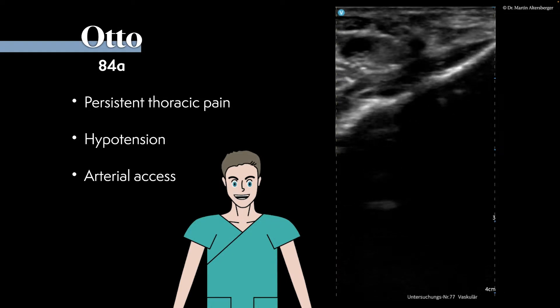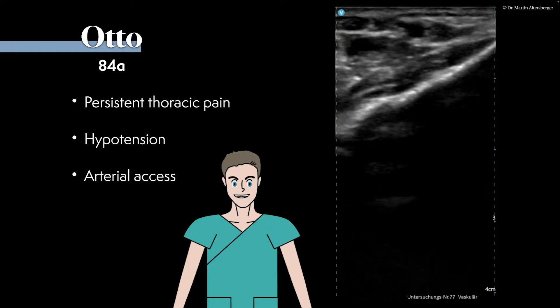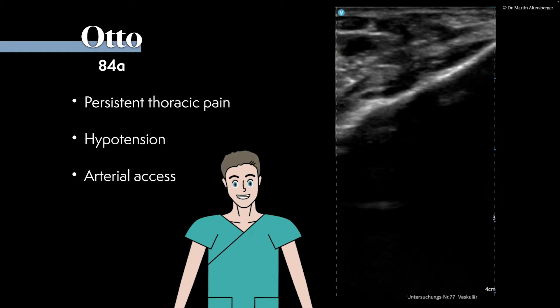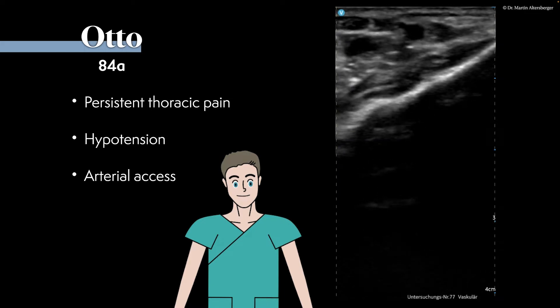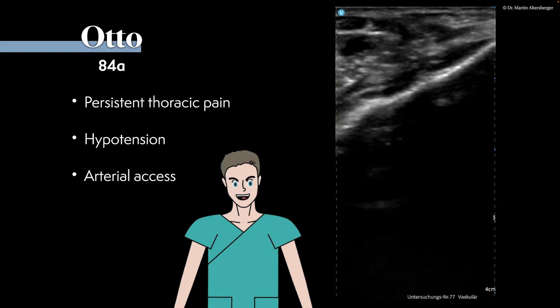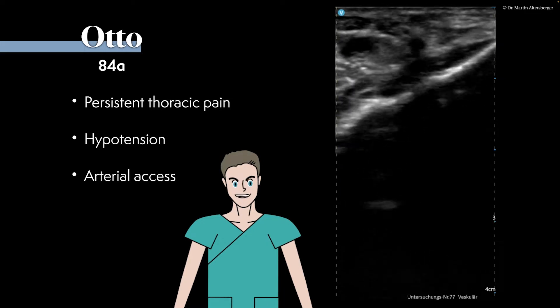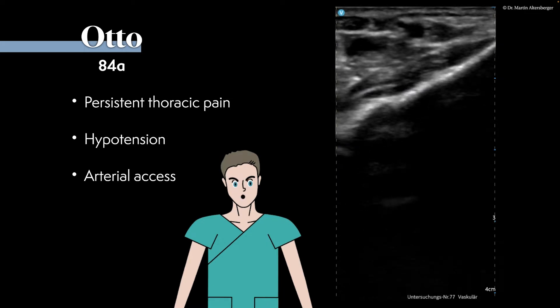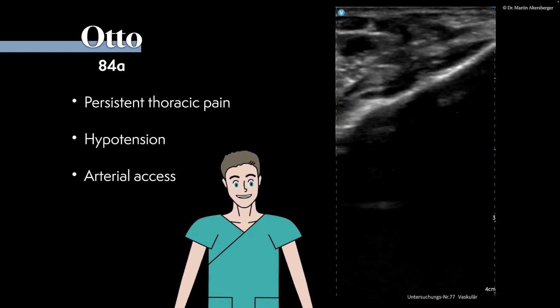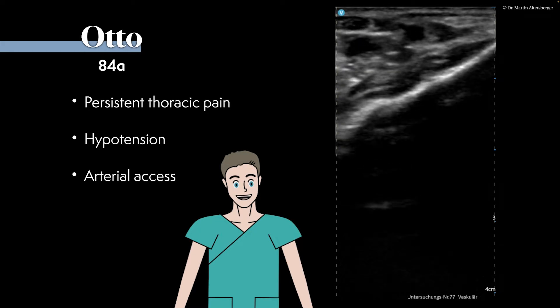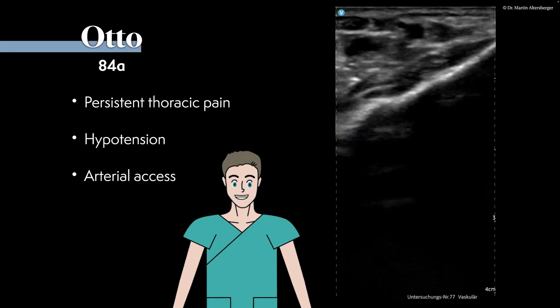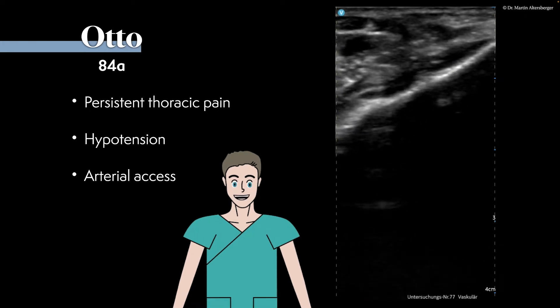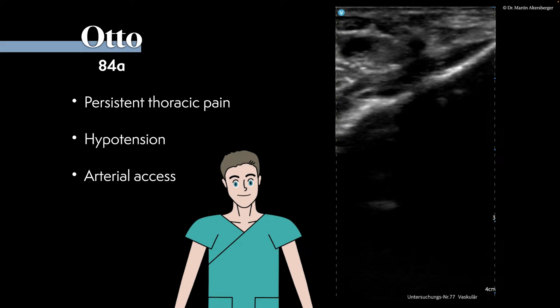Another patient I want to show you is Otto. Otto is 84 years old. He has persistent chest pain for some hours. He's hypotensive, and in this loop you can see the radial artery — this is placing an arterial access.